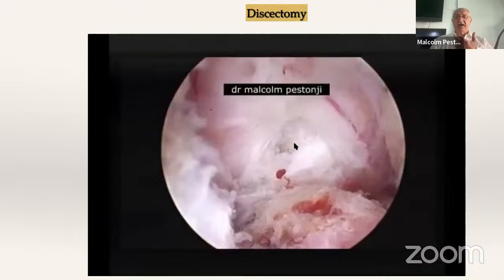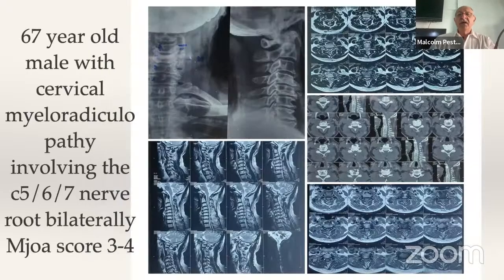So in cervical, I use it for discectomies. Now, I also use it in patients with myelopathy. Here you have a 67-year-old patient with cervical myeloradiculopathy in both hands involving multiple roots, and the patient was not even able to hold a spoon.